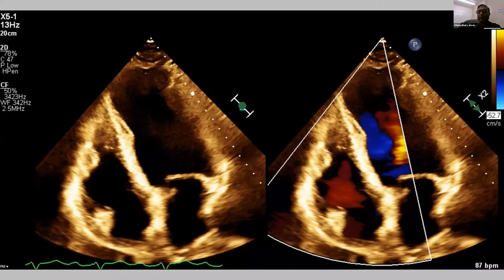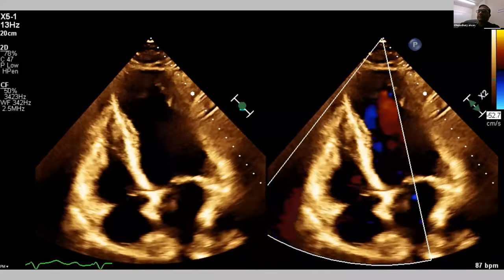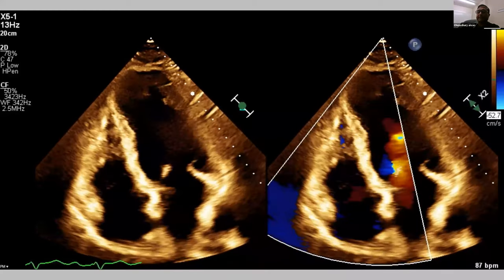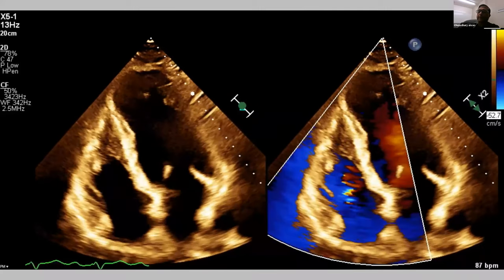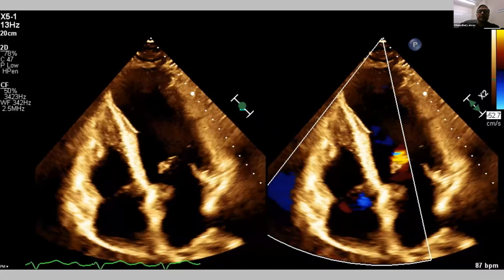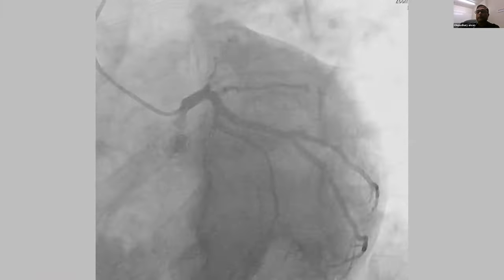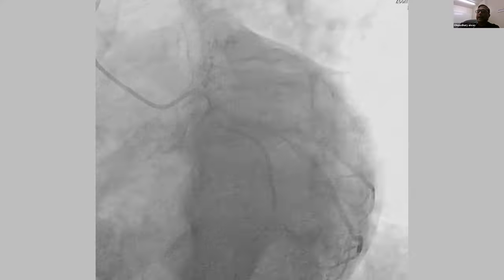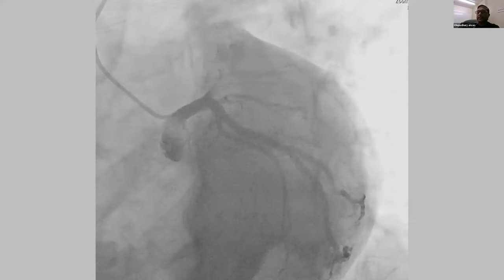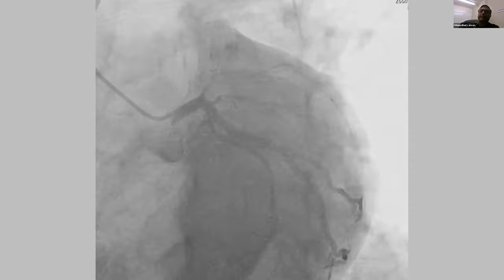But we saw this. You know, sometimes in the COVID time, we see typical Takotsubo with the inflammatory surge or stress surge, like emotional stress, sympathetic pathway, inflammatory pathway, and rarely serotonin pathway, typical classic Takotsubo. But here, it is more of a regional wall motion, and the LAD was occluded, which is not a surprise, correct? The new right bundle, 10 out of 10 chest pain, and the ST segment in V5, V6 elevated with the right bundle.